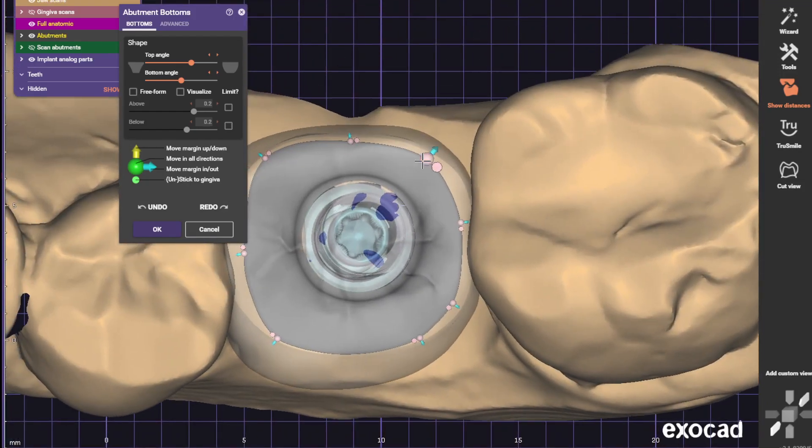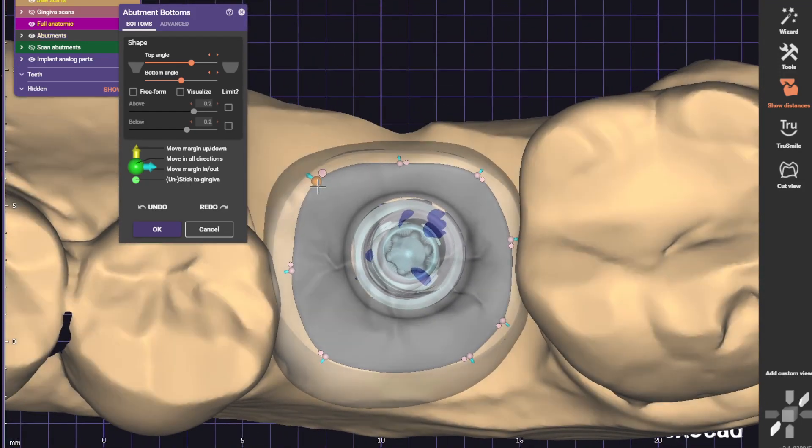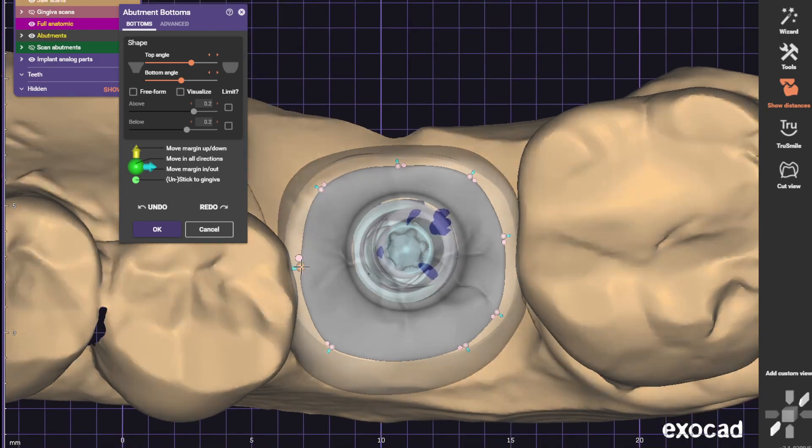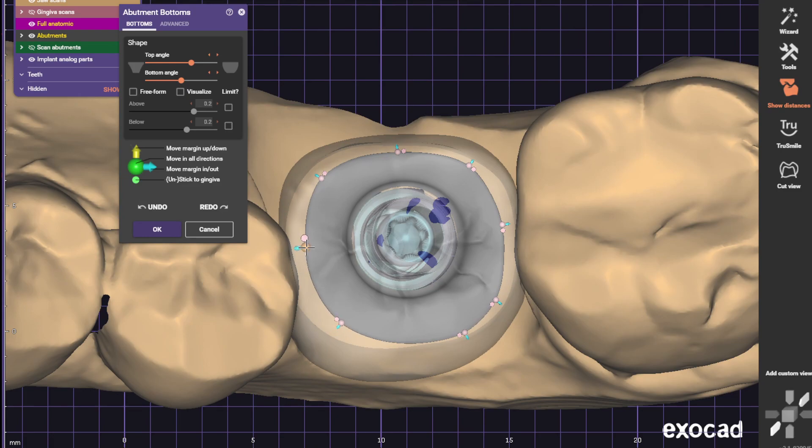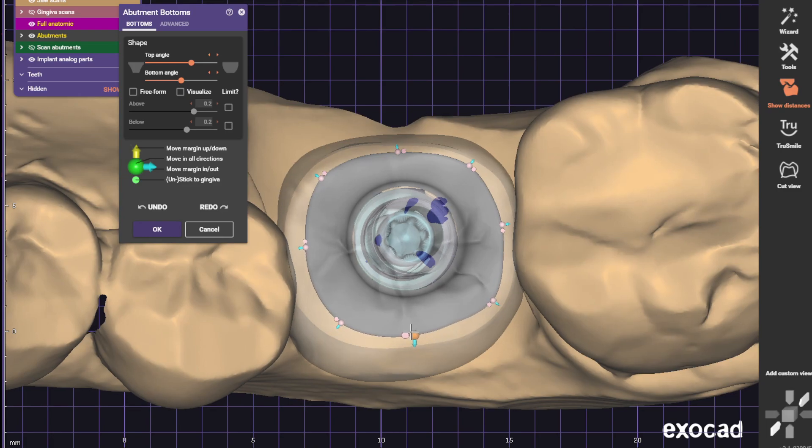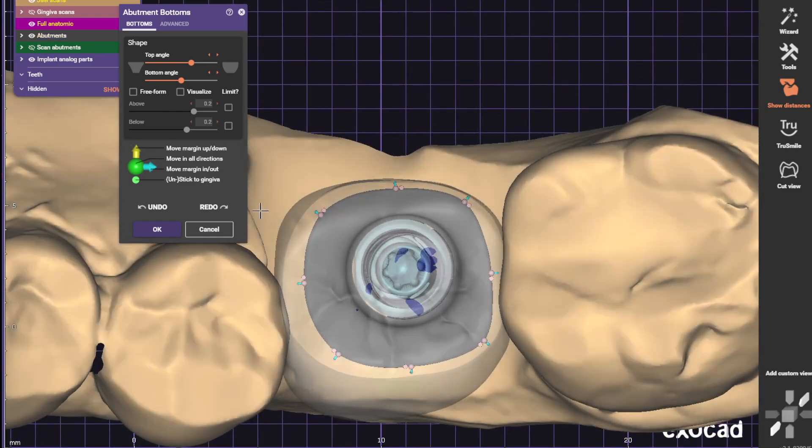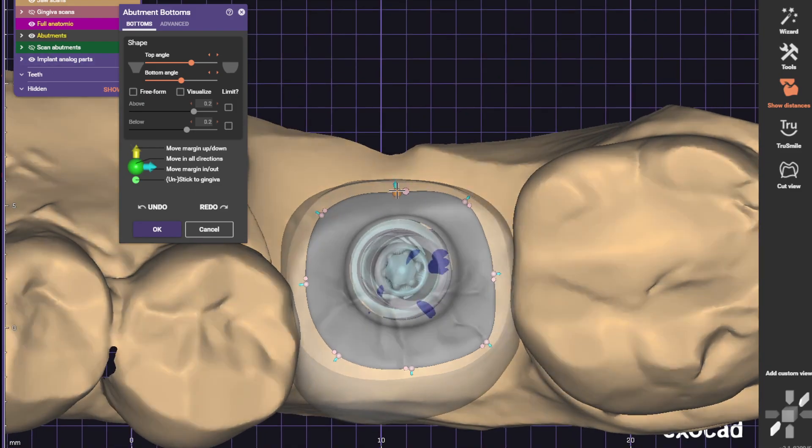Alright, we want to keep these as square-shaped as possible. We want to follow that shape of the tooth like this, okay? And let's make sure that margin isn't underneath the contact area, otherwise they'll never be able to set this crown.